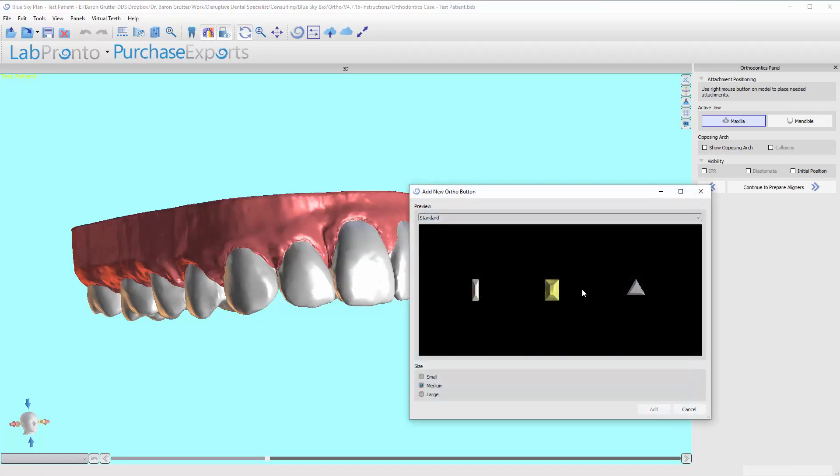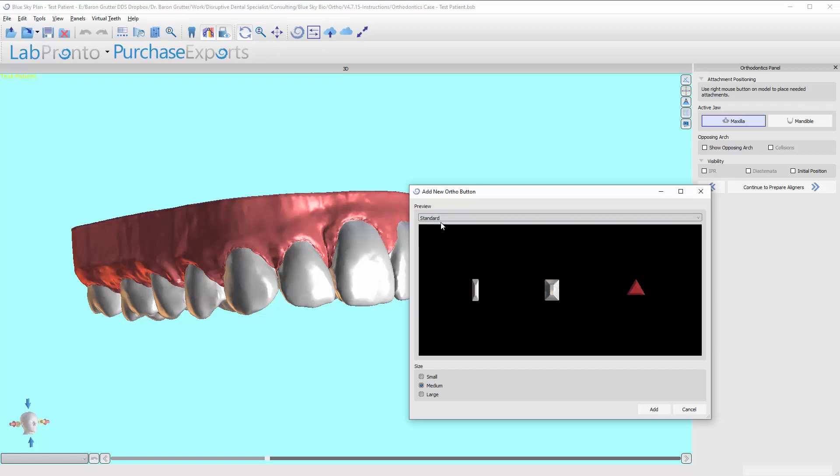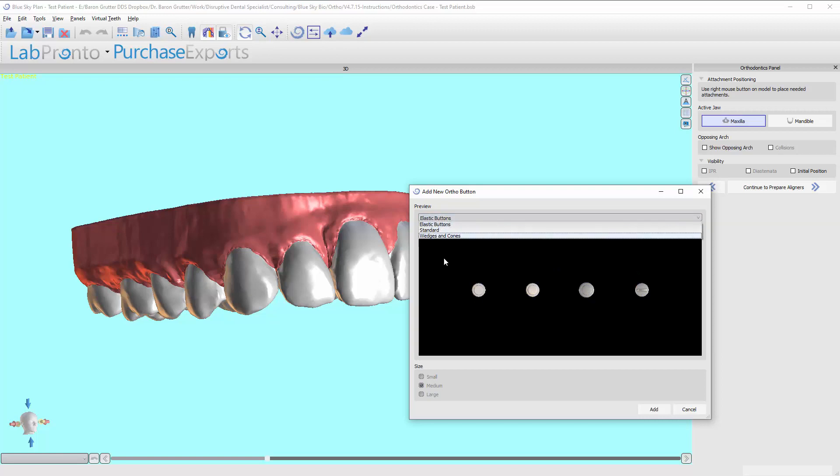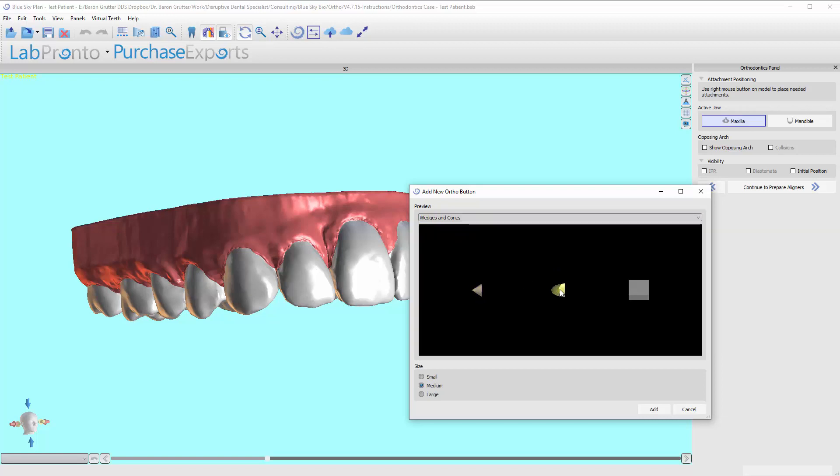We have these standard buttons, this tiny little button rectangle. We have this larger rectangle and then this triangle. We also have elastic type buttons that you can attach elastics to. And then we also have this cone and an ellipse and then a wedge.